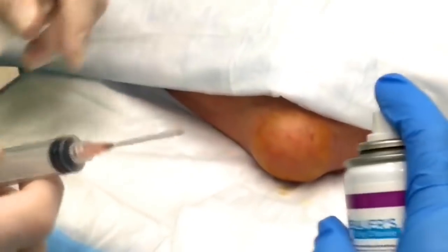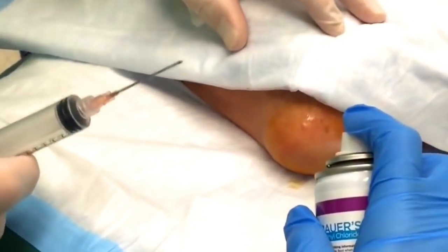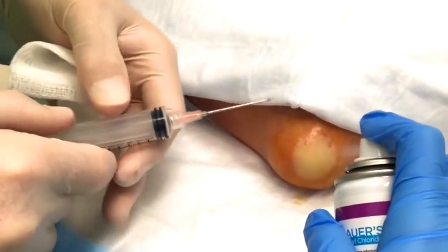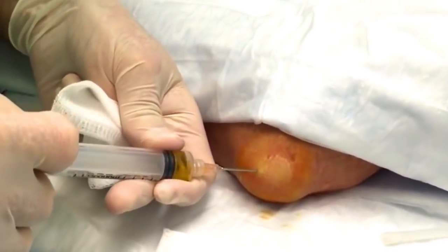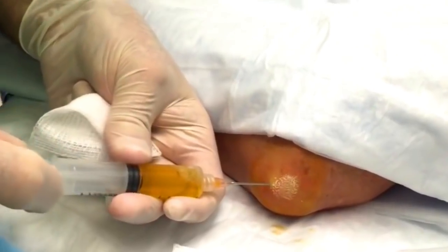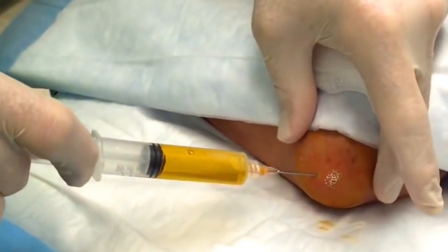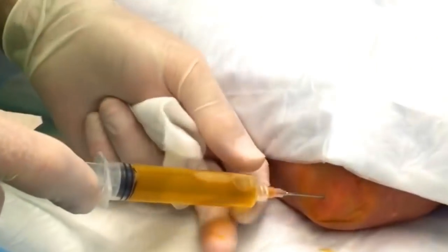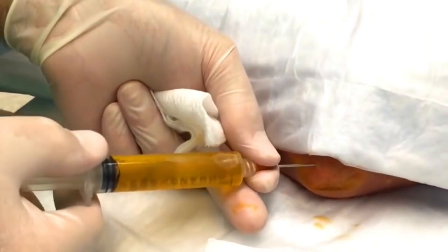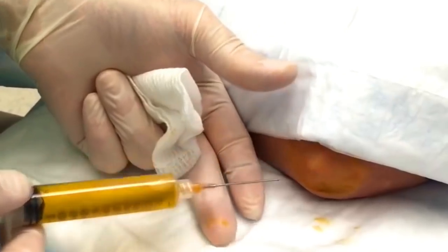So we have our cold spray. You ready? There we go. Nice and cold. More. Good. Little stick, okay? If you feel any pain, you're going to tell me, right? I'm going to try to. Look at all this fluid coming out, guys. Oh, wow. That's a lot. It sure is. In fact, we're going to pull this out, and we are going to get rid of it.